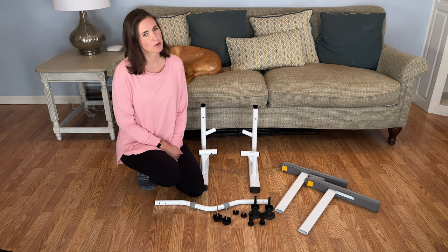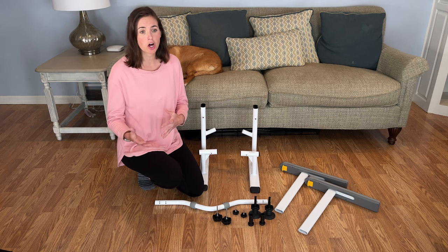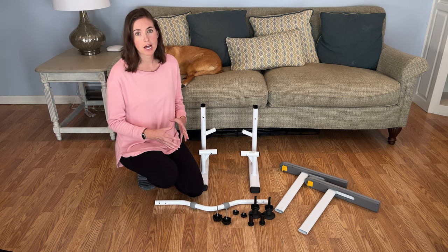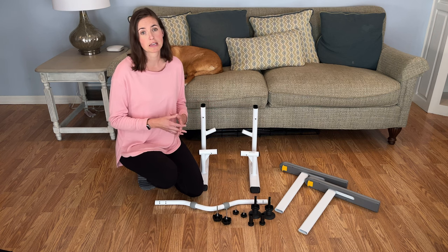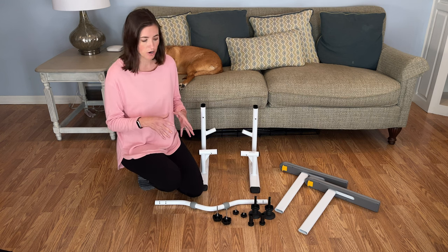Hi everyone, it's me Lindsay with EquipMeOT here today to talk about how to assemble, install, and my general review of the Kamina Toilet Seat Safety Frame. This is a great product, a real upgrade from the traditional safety frames. I'll talk about how to put it together, how to mount it to your toilet safely, and some of the features I really like about it in comparison to some of the other models on the market.